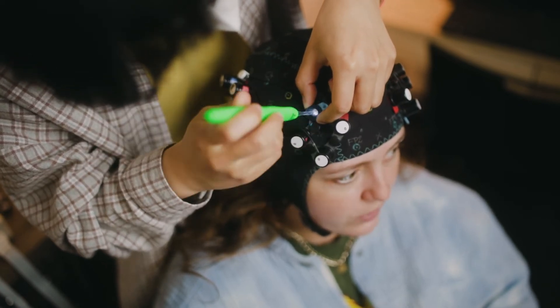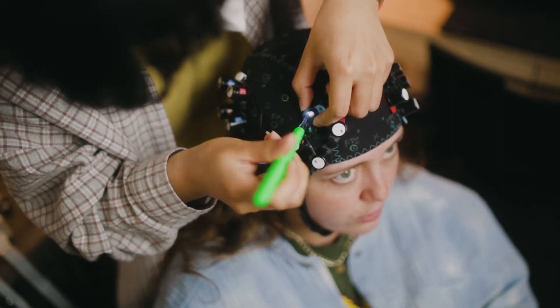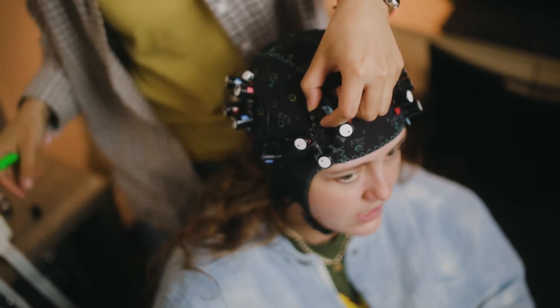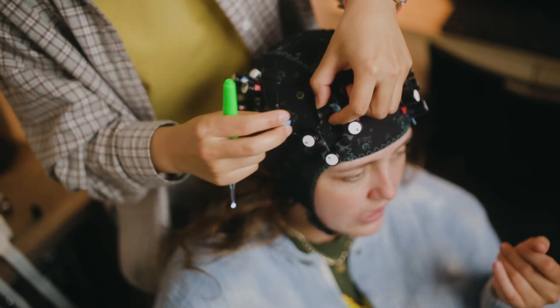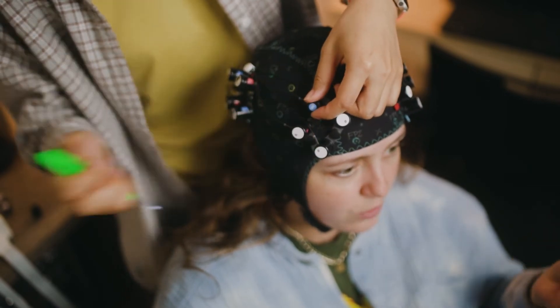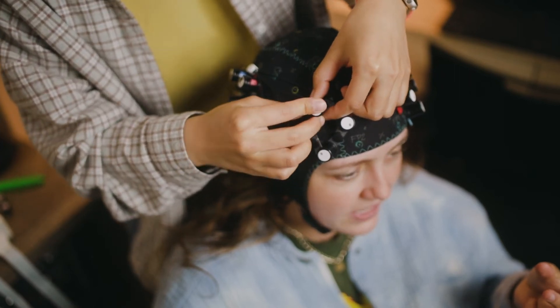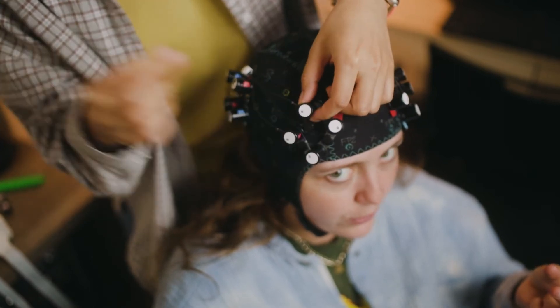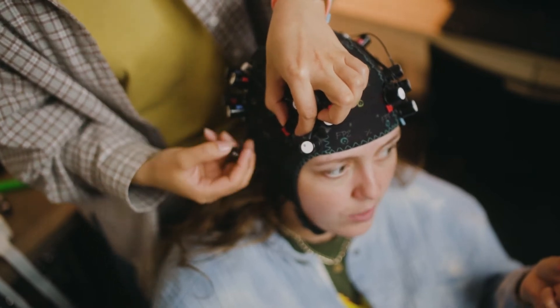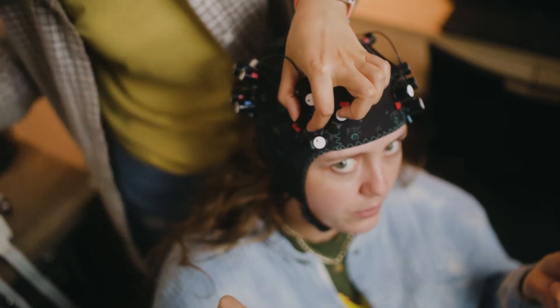Once she runs optimization and sees which channels don't have any signal, she'll go to the optodes, take off the spring topper first, and then the optode itself. She'll hold the optode in one hand and use her fingers to hold the hole or slit against the scalp. In the other hand, she will use a crochet hook to part the hair and expose the scalp, because a lot of the issues with signal is hair blocking the way.